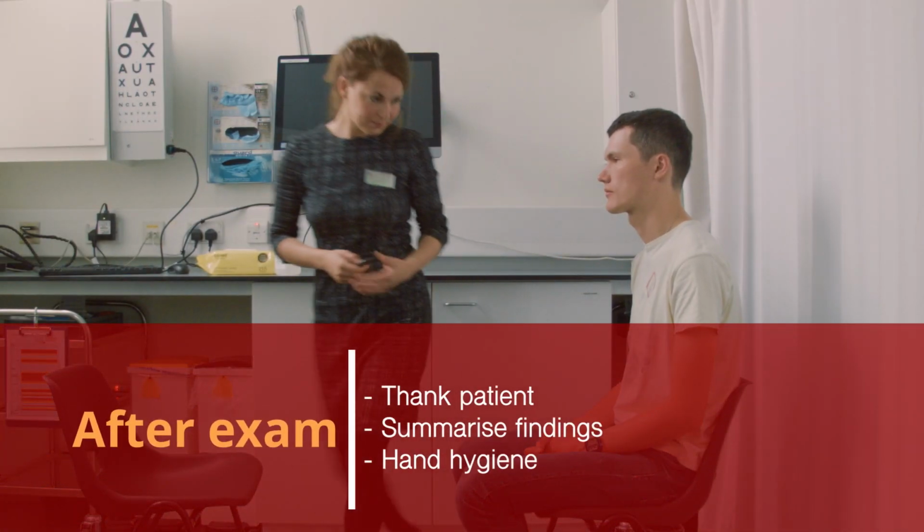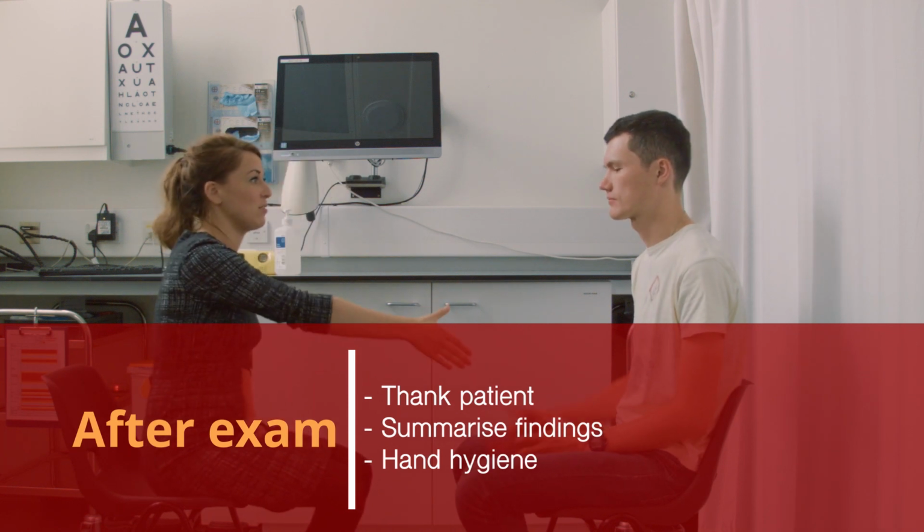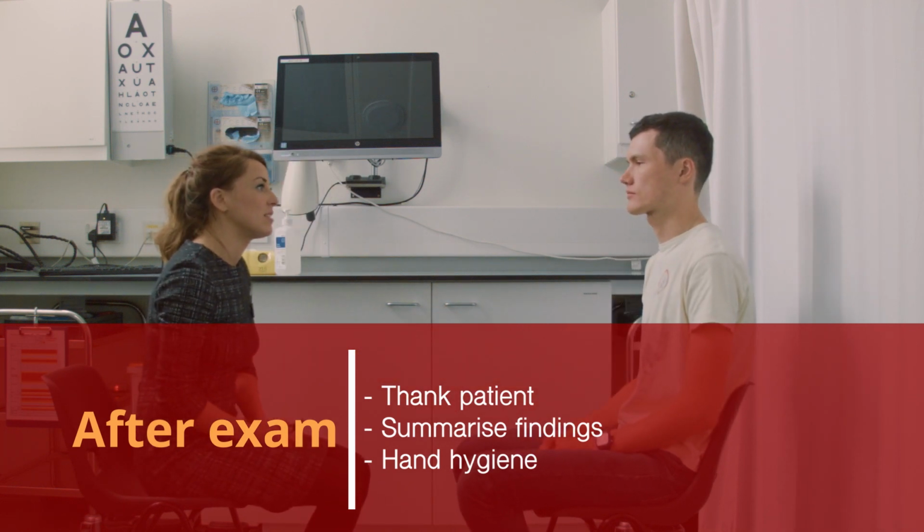After the examination, thank the patient, summarise your findings and repeat hand hygiene. Please have a look at our other University of St Andrews ArcLight project videos.